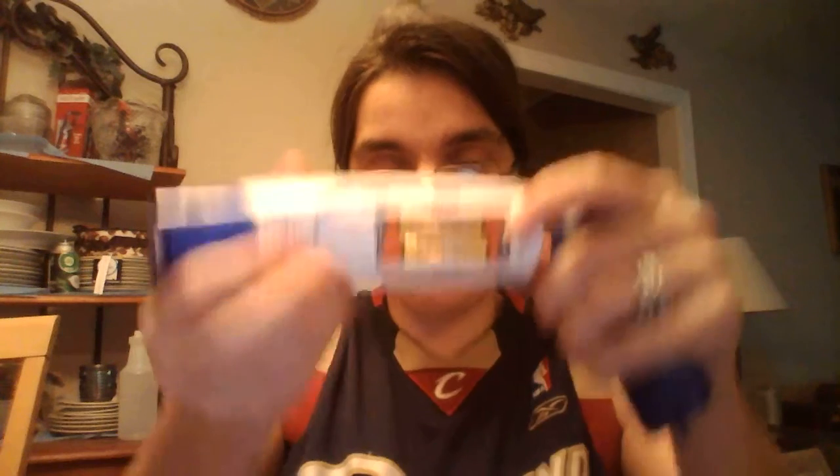There's no beeping or nothing. You just hit the ear like this — one, two, three — it gives you a little beat and you're done. Now I do have to sanitize that. There are many functions that I like about it. It takes two AAA batteries that do come with the product.